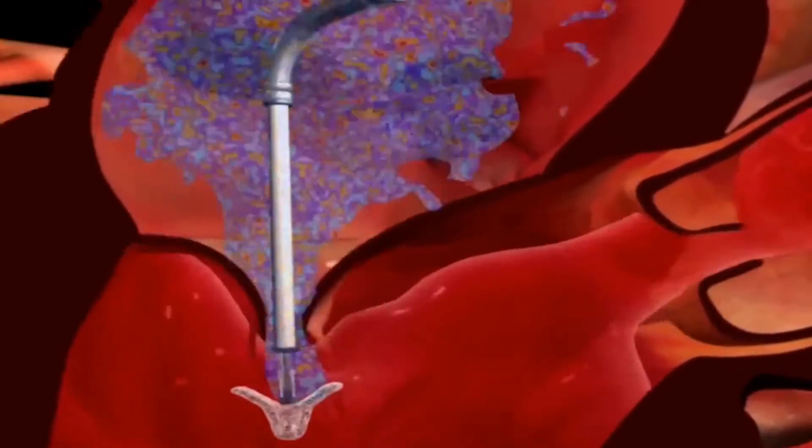For each valve of the heart they're constructed in a different way, so you need a different type of procedure to treat it. When we're treating patients with a TAVR, for the most part those patients have a valve that's too tight — that's called a stenosed valve. For the mitral clip procedure, the valve is actually leaky and we're making it a little bit tighter or stenosed.